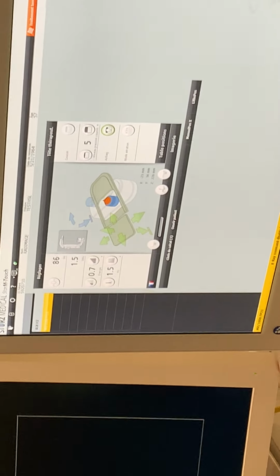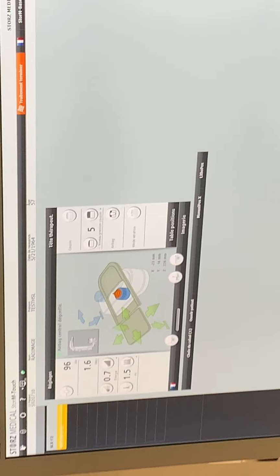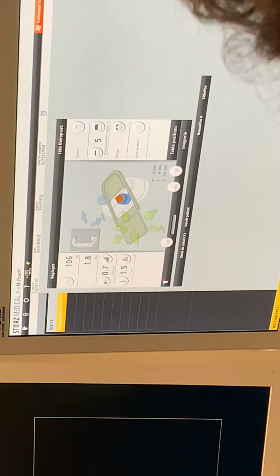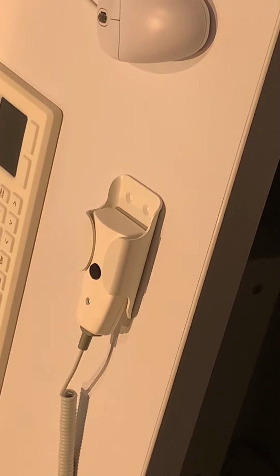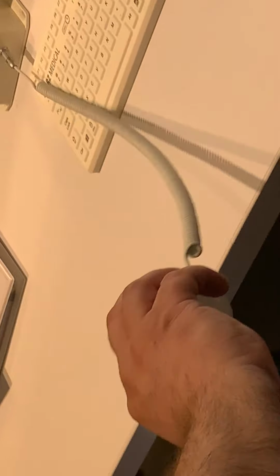Now we cannot move the table, but for example, we want to do an X-ray now, and we want to move the patient because the stone moved. We need to unlock the system, and therefore we have another button. This is this black magic button on the back side of our shockwave release button. Have a look what is happening if I press this button now, especially in this area, to the table and to the airbag. I will press it now and keep it pressed.